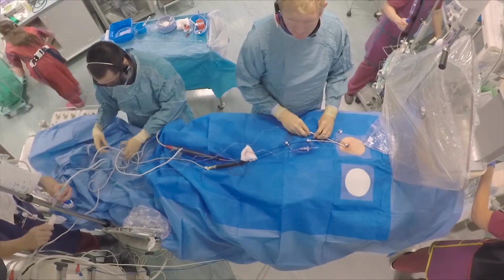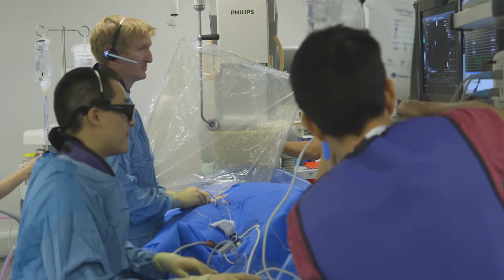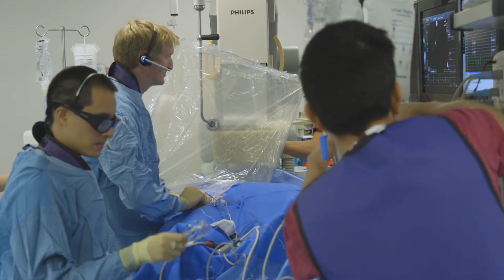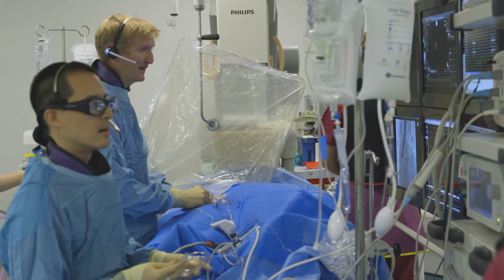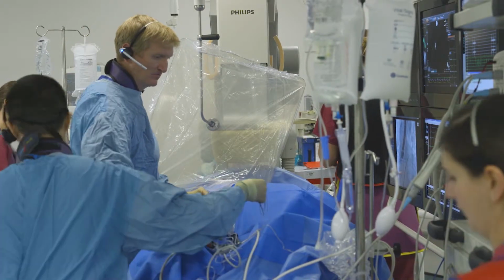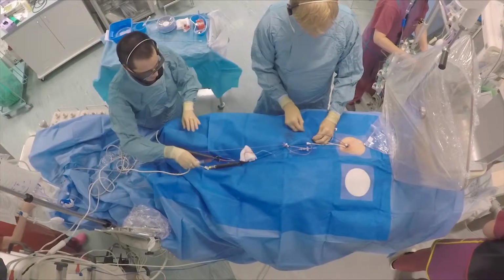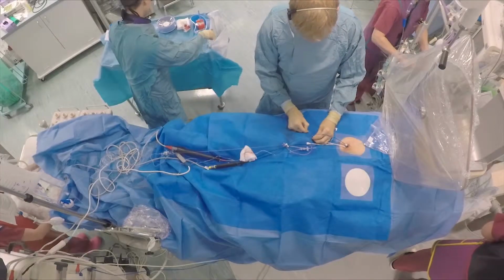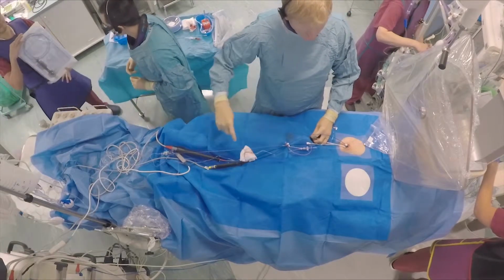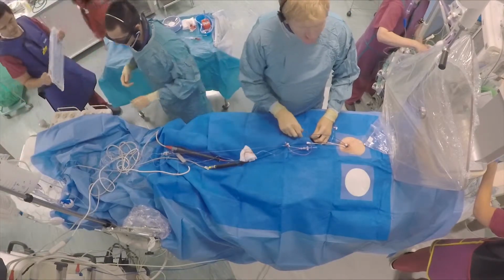Here you can see that I'm using both fluoroscopy, but mainly the transesophageal echocardiogram, and by doing so I've now done the transeptal puncture safely and efficiently. I'm going to start dilating up the PFO so that I can pass my ablation catheter through the same puncture site.